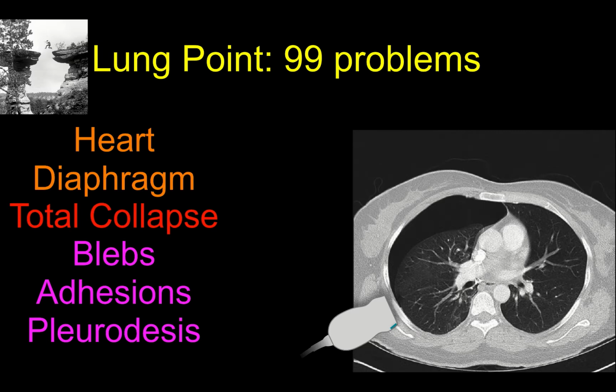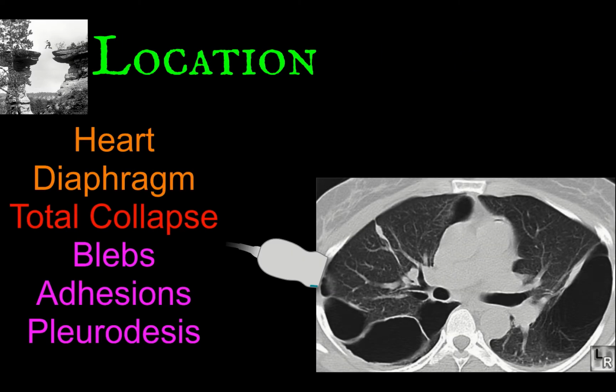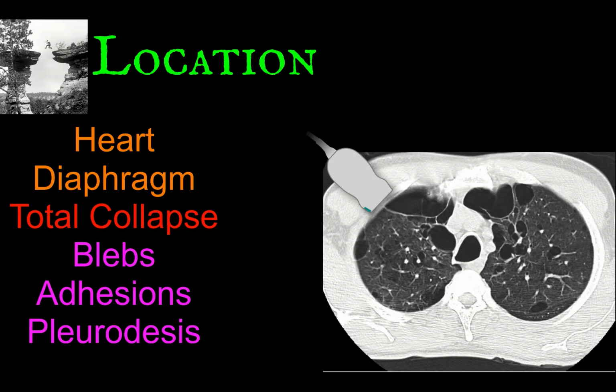First, make sure that the lung point makes sense and that the lung point is actually dependent. Posterior blebs might look like a lung point, but it will look backwards. The sliding will be more anterior, and the dependent portion will be where the air is. Now, what about more pesky anterior blebs? If you're less worried about the spine, you can certainly sit the patient upright to see if the pneumo and consequently the lung point will move to a more antidependent region, which a stuck-on bleb or pleurodesis adhesion will not.